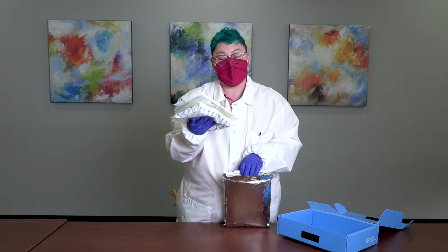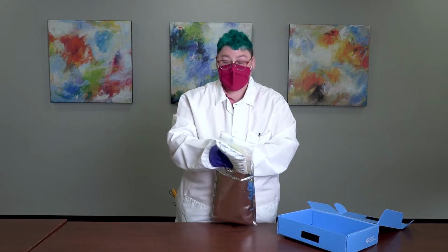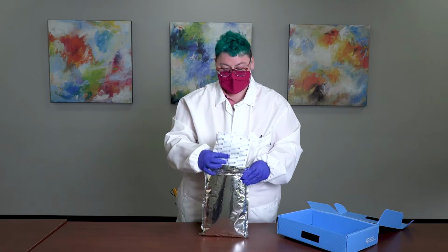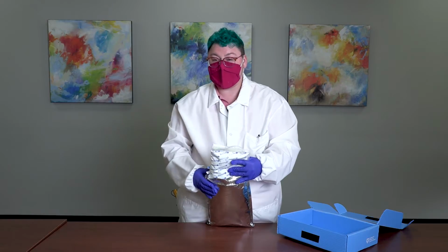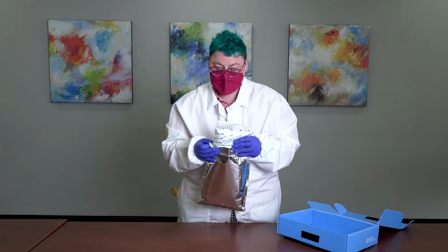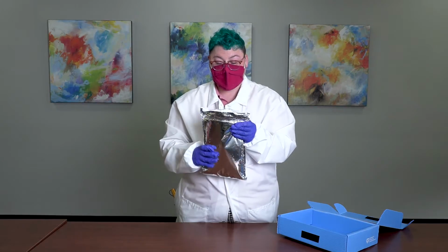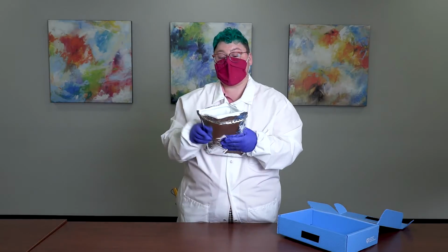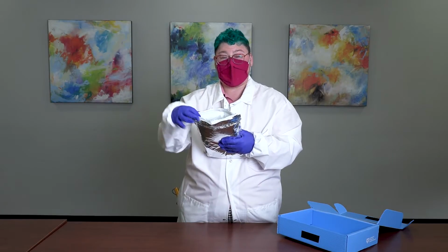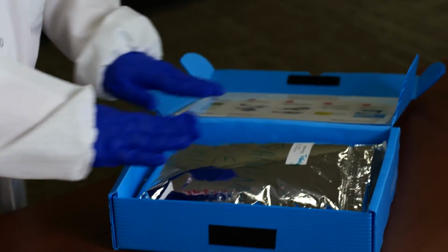The cord blood unit, maternal samples, and gel pack will be slid into the foil pouch for transport. If you've collected a very large unit, this could be difficult, but we recommend slowly shimmying this into the bag. This will give us nice, even flaps. You may notice there's a zipper at the top, like you'd find in a Ziploc bag. That does not need to be closed. The whole entire foil pouch will go back into your collection box.